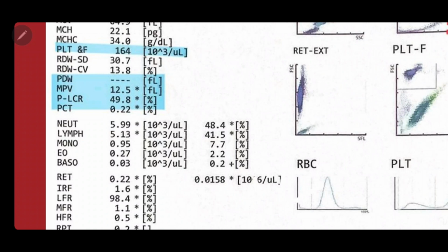Now, for monocytes, the normal value should not exceed 1.0, or in percentage terms, 3 to 10%. This indicates that there's been some abnormality for a while, but not exceeding 7 days. For eosinophils, the value should not exceed 0.4, but can be accepted up to 0.8. Therefore, in this case, we disregard it. Basophils can be accepted up to 0.03. In this case, it's borderline between infection and no infection.